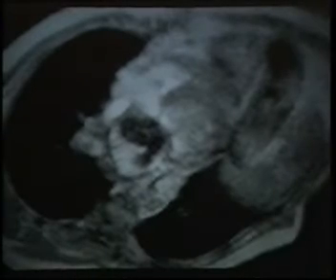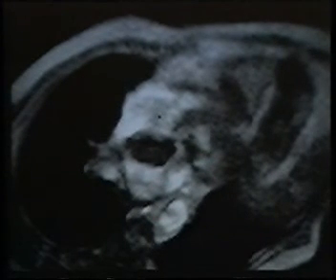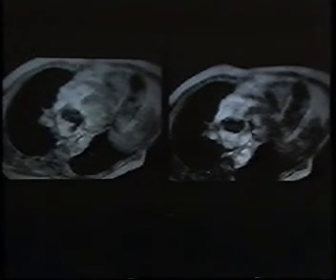This is essentially the same as a dilution defect on a normal angiocardiogram or a contrast angiocardiogram, and it's going to diffuse with time. Look at this case, which is a complex compound oblique view. This is a left atrial myxoma, and this is mitral insufficiency at the corner of the valve during ventricular systole. But then during ventricular diastole, you don't see the insufficiency anymore, so this is evanescent, but the shadow of the tumor remains the same throughout the cardiac cycle. So in order to diagnose a soft tissue tumor, it has to be a persistent defect on your films.